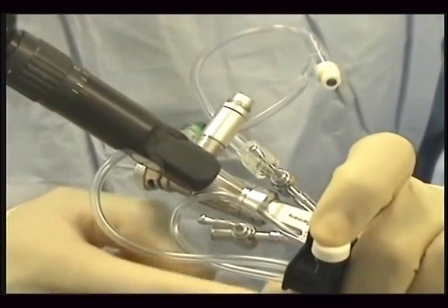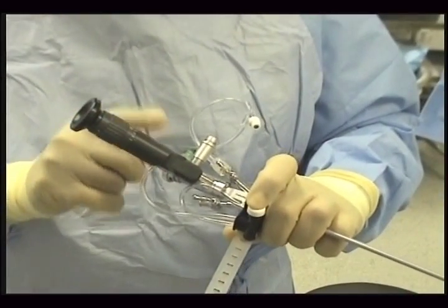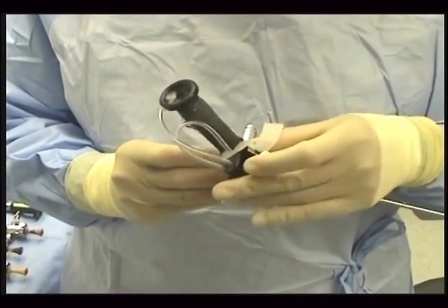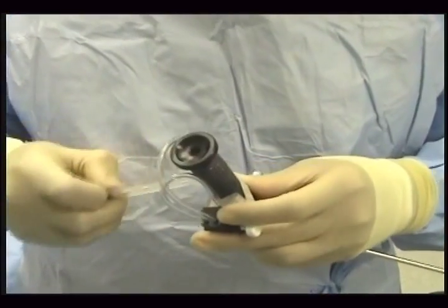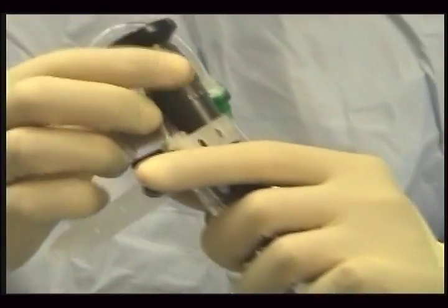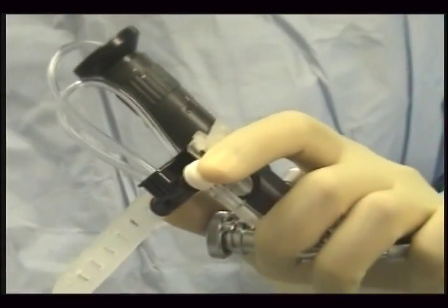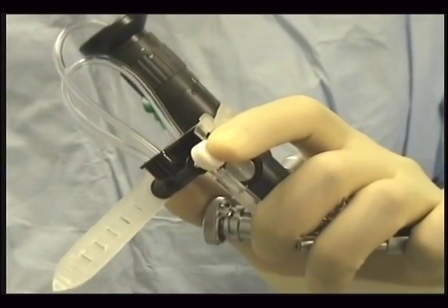Alternatively, if you do not want to mount it here and you want to mount it on the eyepiece itself, you can do that too. Once you have placed it here like so, strap it around and hook it. Now you have it on the eyepiece and you can hold the scope like this. Your right hand is free for instrumentation while the flow is being controlled by this one hand.